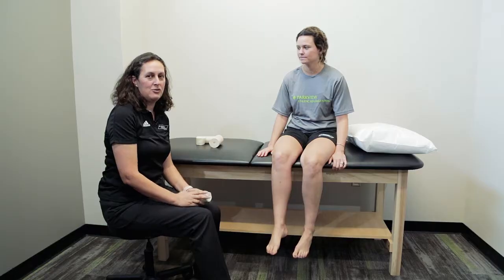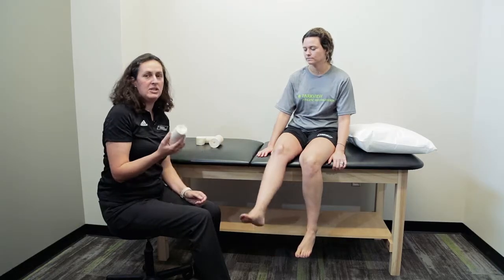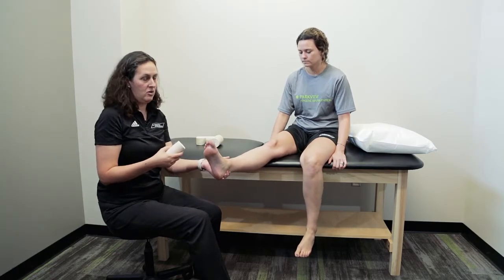Hi, I'm Candace Duncan. I'm one of the athletic trainers with Parkview Sports Medicine and today we're going to talk about proper use of a compression wrap. Today we're going to use a compression wrap and wrap an ankle. I'm using a medium-sized compression wrap due to the size of the ankle.